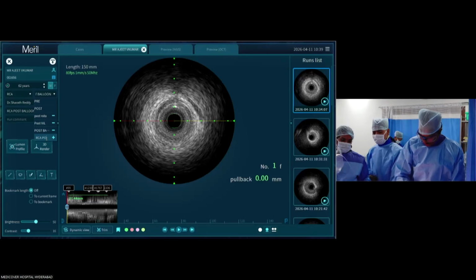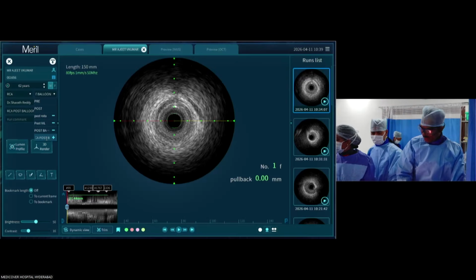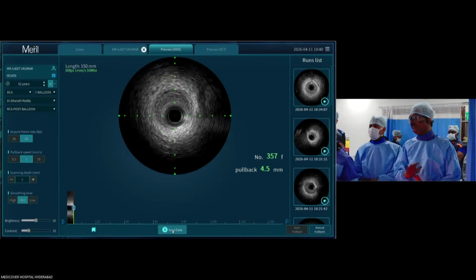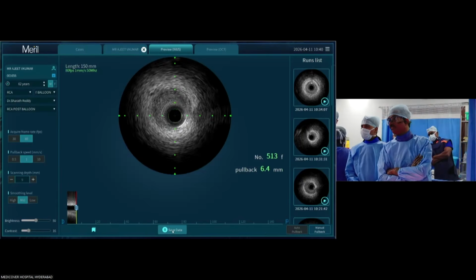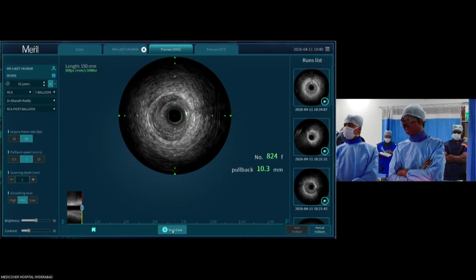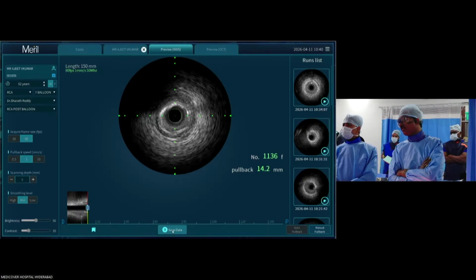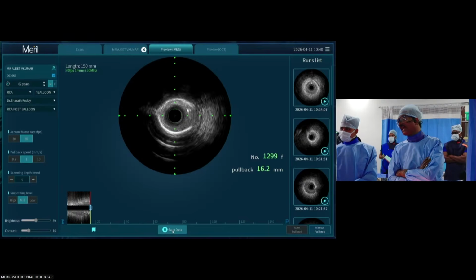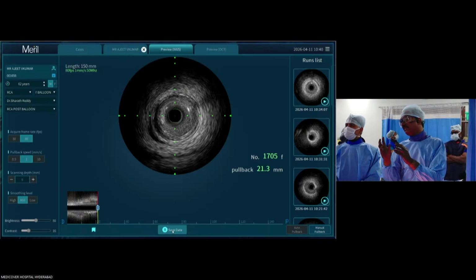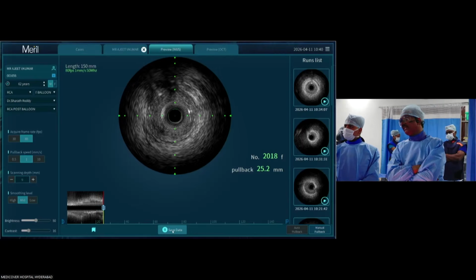I feel more and more comfortable leaving dissections. If I have any questions about the support, then I would always prefer an Amplatz. So in this case, one more problem with an AL is that it becomes very difficult to do IVUS-guided cap punctures in the RCA.